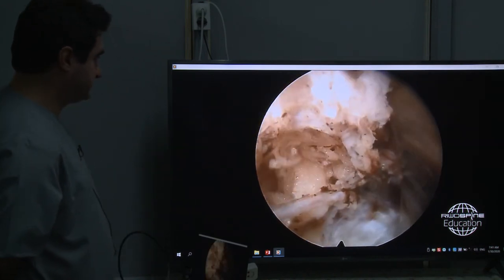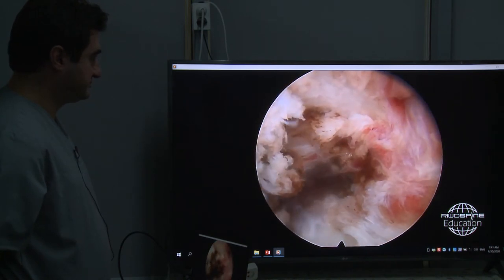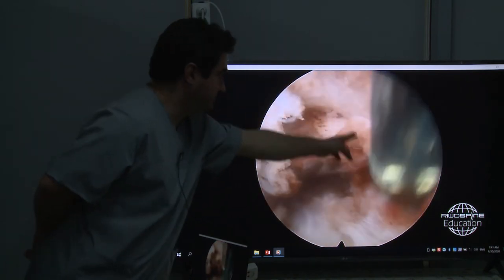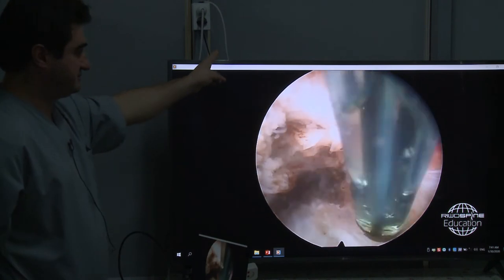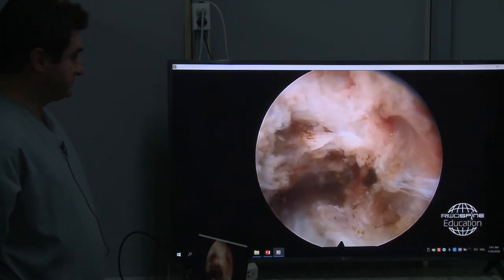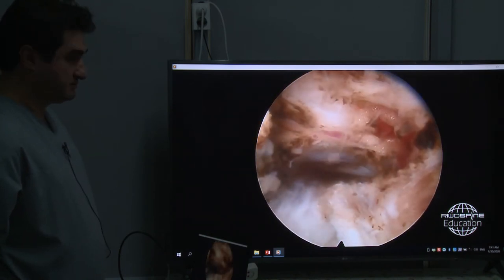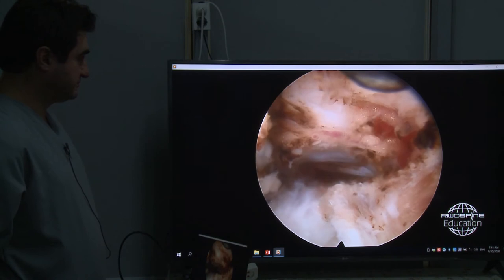So I finish the operation now, because the decompression is done. That's the pedicle here. There we normally start the extraforaminal approach. That's the ascending facet, that's the entry to the spinal canal. You see the decompressed neural structure.